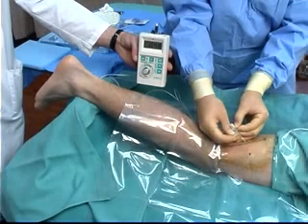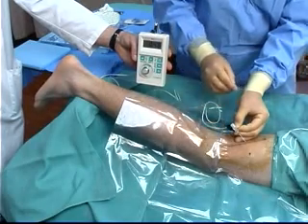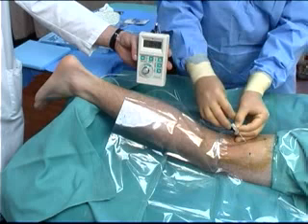The needle enters the skin at an angle of approximately 45 degrees pointing cephalad and the bevel pointing upwards to facilitate easy catheter placement. It is advanced until the sciatic nerve is stimulated.